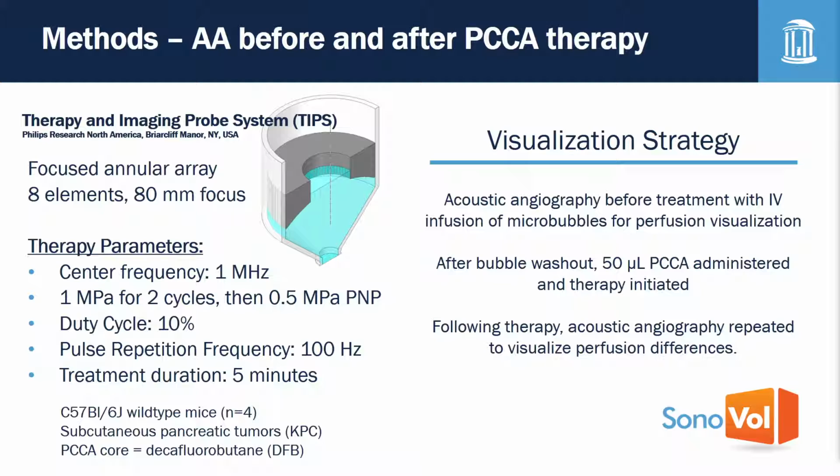of decafluorobutane core phase change contrast agents and initiate 5 minutes of treatment, with each pulse beginning with 2 higher pressure cycles to induce vaporization, followed by moderate pressure cycles. After treatment, the animals were positioned back onto the imaging platform, microbubbles were infused, and a second acoustic angiography scan was acquired.